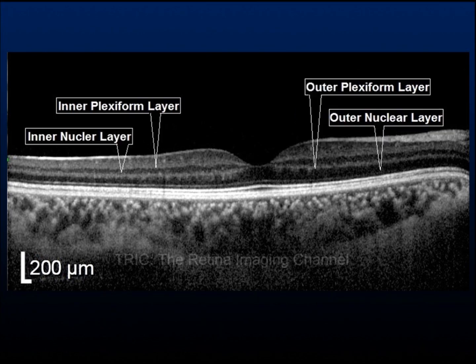Next there are striations which make the retina a banded structure on OCT. There are two hyperreflective bands and two hyporeflective zones. Starting from the inner side of the retina, the first hyperreflective band is the inner plexiform layer, which is followed by a hyporeflective zone which is the inner nuclear layer. They are followed by the hyperreflective outer plexiform layer and the hyporeflective outer nuclear layer.